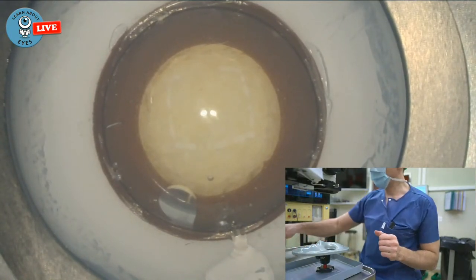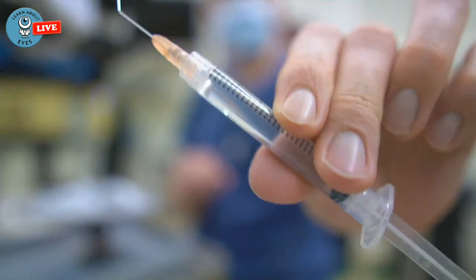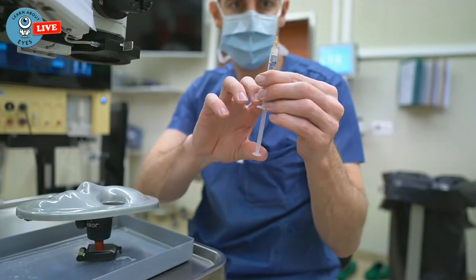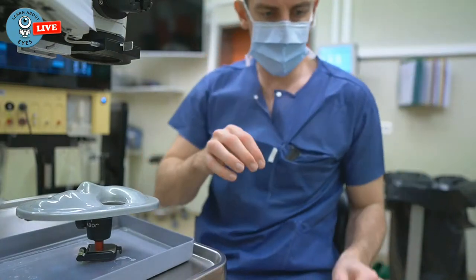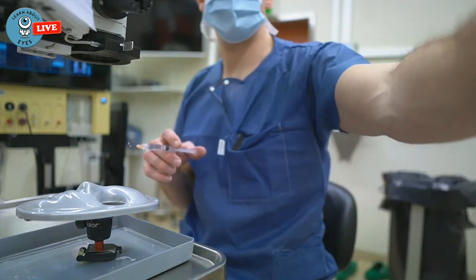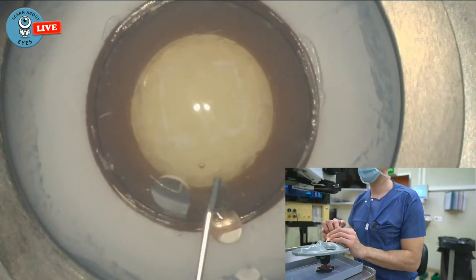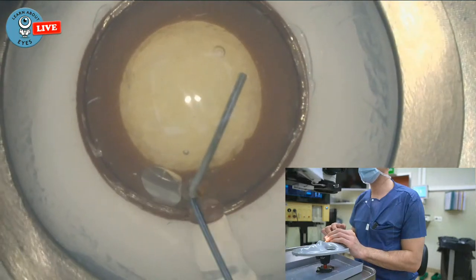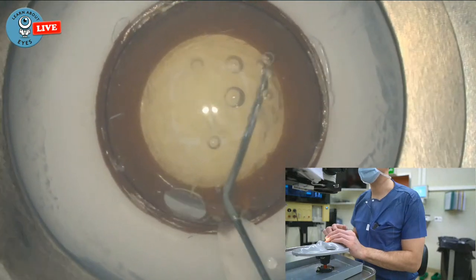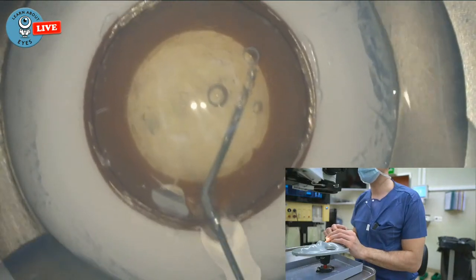Okay. Now, I've got some saline in a syringe, we're gonna use that to do our hydrodissection. Now these eyes don't really do hydrodissection well, but I kind of just act as if. You do need to, it's so hard, you do need to go underneath it quite a lot, and it still doesn't really do too much. And of course, you can't see the wave or anything.